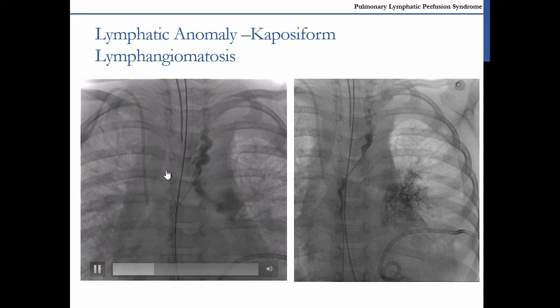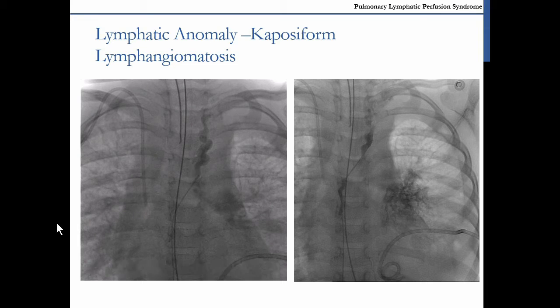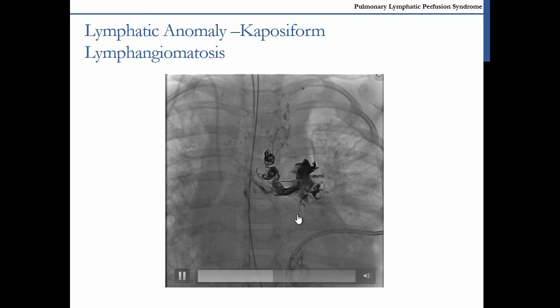But this is our first case. So you can see clearly nothing goes to the subclavian vein. Instead, all lymph goes, you can't see it here, but also on the right, left and right, into the subcutaneous interstitial tissue. And this actually explains why she has this interstitial pattern. And we embolize it. It looks messy, but this is coil deployment. Because it's such an enormous one, I used different techniques. In this country, we didn't have glue and other stuff.